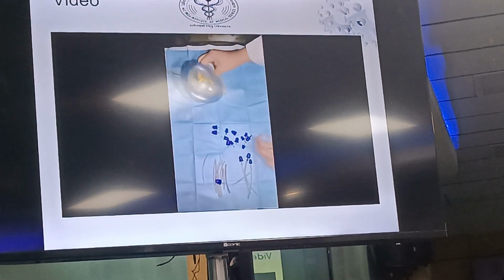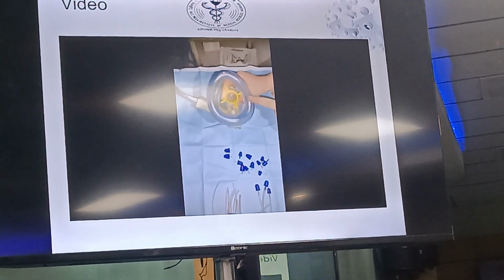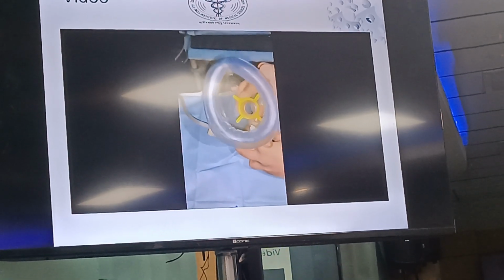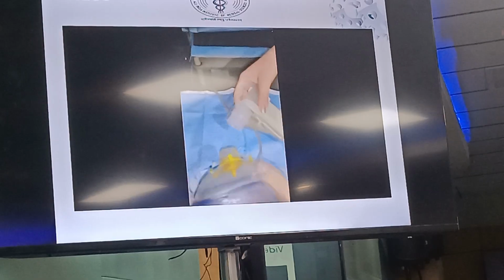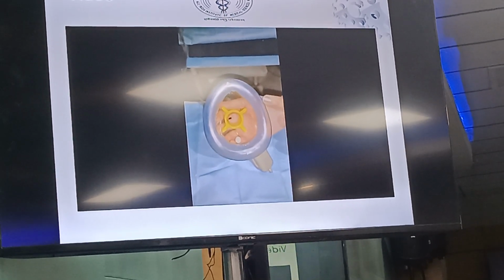This is the mask which is used to measure the nasal resistance. The mask is also available in different sizes according to the age group of the patient. The mask should be snugly fitting upon the patient's face, and there should be no air leak.